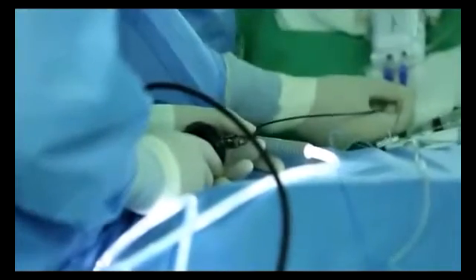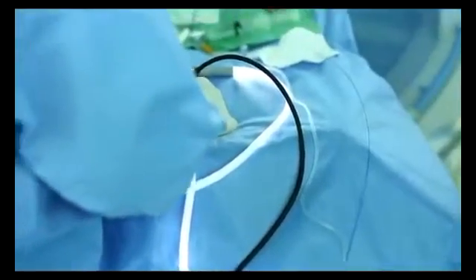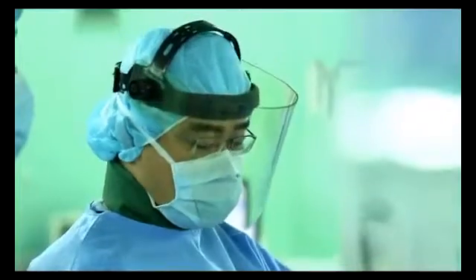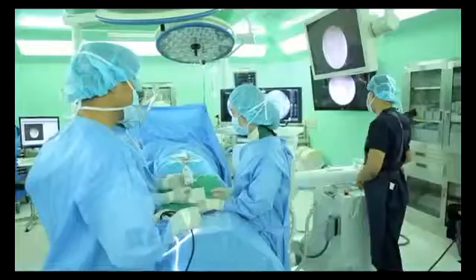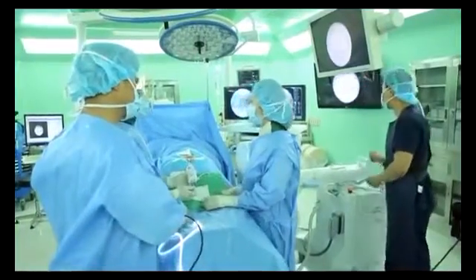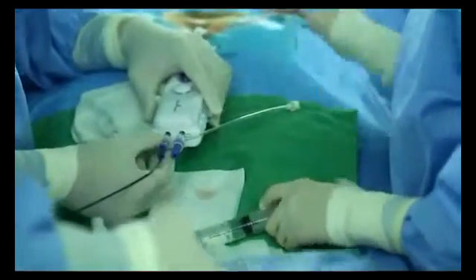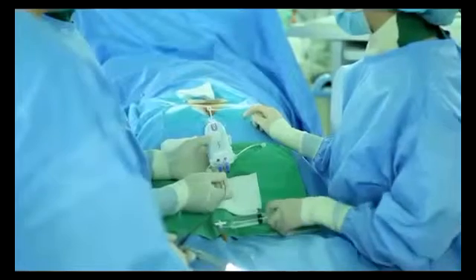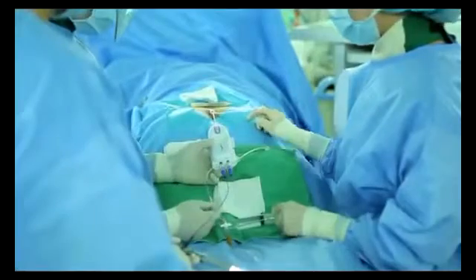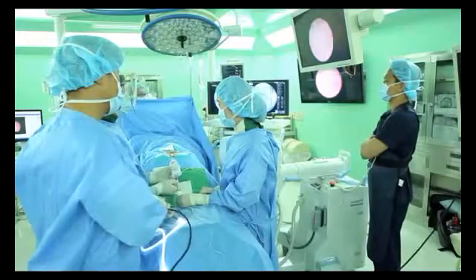Endoscopic cable is a consumable. As it is used, the resolution will get poorer and poorer. The skillfulness of SELD will have an impact on the shelf life. If it is of too low resolution to be used, it should be replaced. If not, you may clear the view by pushing saline. If the view is interfered with by epidural fat, you may repeatedly insert and take out the endoscopic cable while pushing saline to remove the epidural fat.